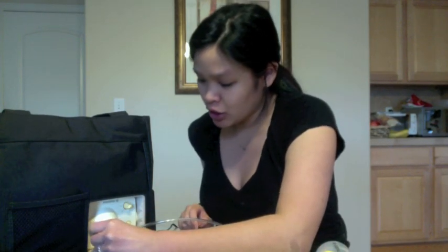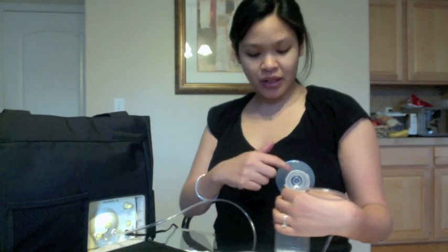So I'll kind of show you what it's like to use the pump. If everything's connected, you want to just go ahead and put it straight to your breast with the nipple in the middle. And I just hold it if I'm doing one side. If you're doing two sides, it does get a little bit difficult. The first time I was using it, I was using my toes to try to turn the knobs and everything. They make great bras that you can put the nipple shields into, and they just hold and get stuck there, and those are perfect because then you'll have both your hands free.